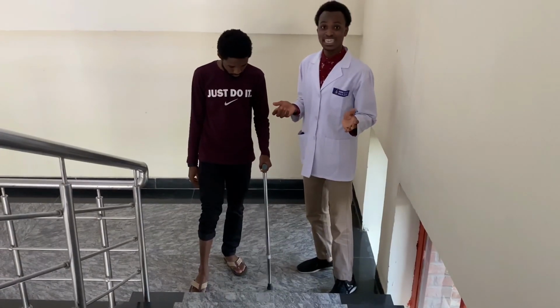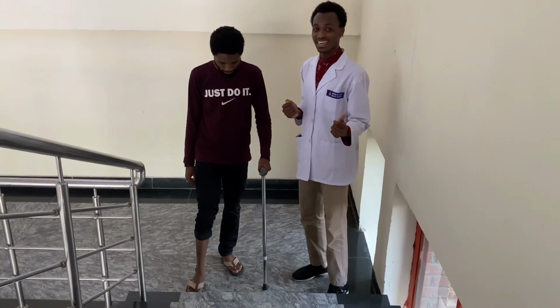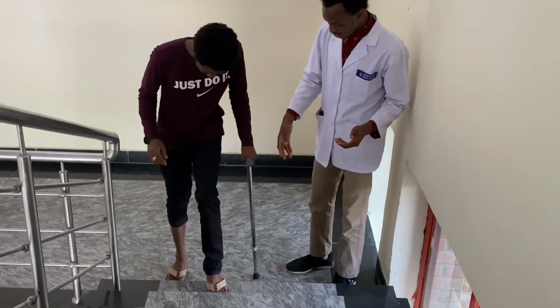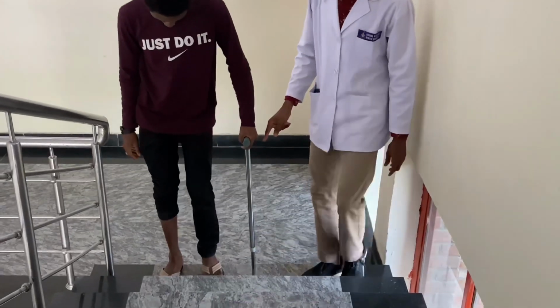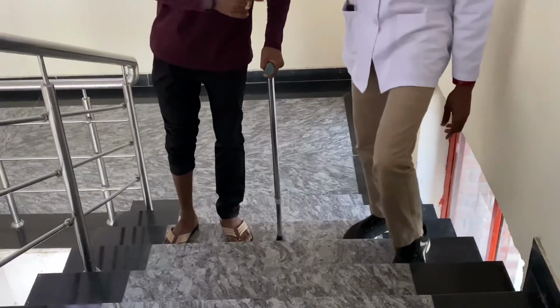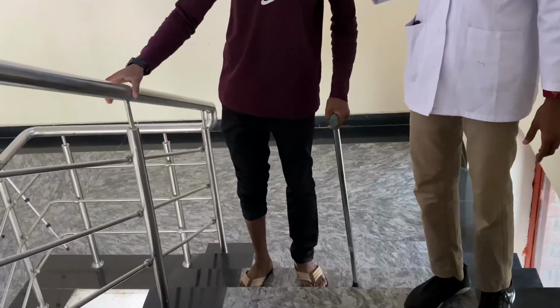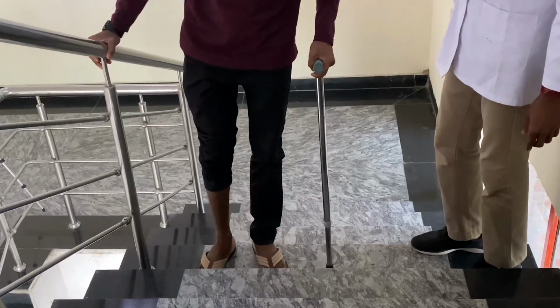Stair activity with cane. We go up with the good leg and we come down with the bad leg. The patient will use the unaffected leg first, followed by the affected leg and the stick. Unaffected leg, affected and the stick. Then we can also hold onto the rail in order to provide stability and support. The patient might use the rail. Unaffected leg, affected and the stick.